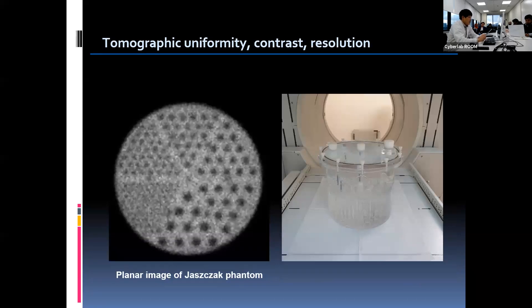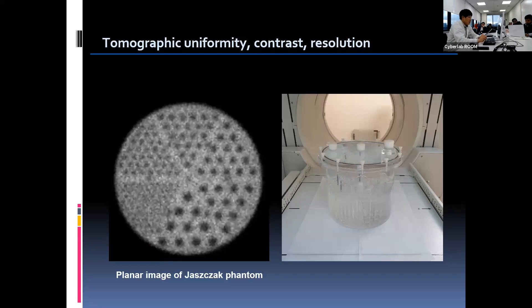This is the planar image of the rod segment in the bottom of the Jaszczak phantom. We get this image prior to the SPECT acquisition, because this can serve as a reference image when evaluating tomographic spatial resolution. For the acquisition, place the phantom on the detector with the rods at the bottom, as described in the image.